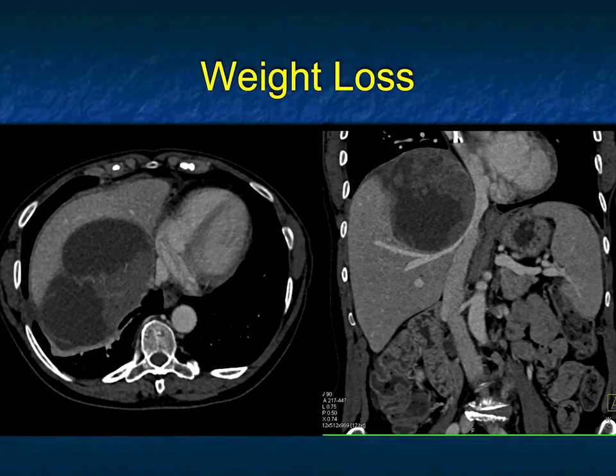This patient has weight loss. You see a complex cystic and solid mass in the liver. Thoughts: primary tumor, biliary cystadenoma, biliary cystadenocarcinoma. Metastasis — germ cell tumor, GIST tumor, ovarian cancer, melanoma.